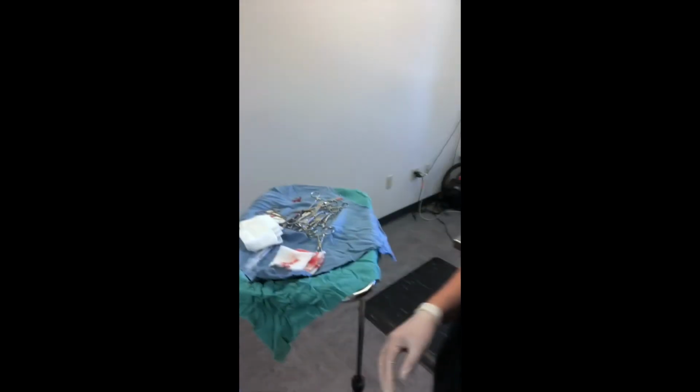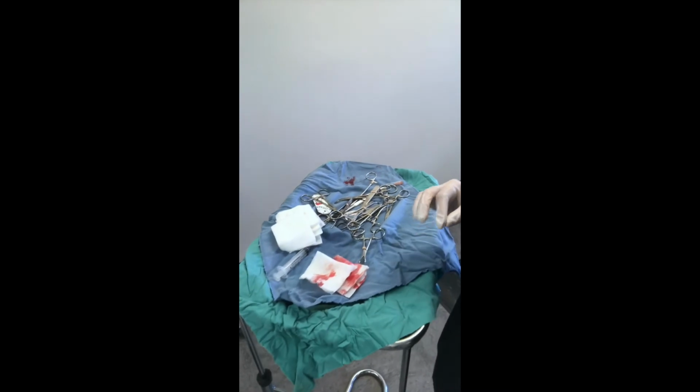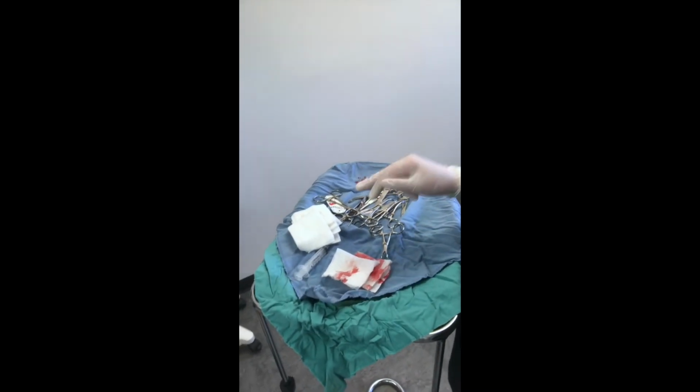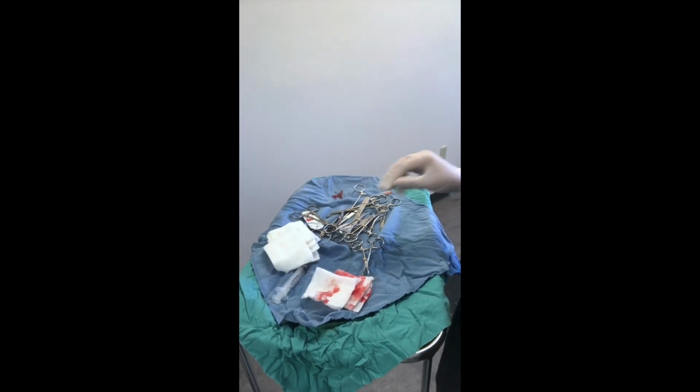Once the surgery is complete, we're going to go ahead and go through all of the instruments to make sure everything is still here. We had 15 gauze in before the surgery and 12 instruments.